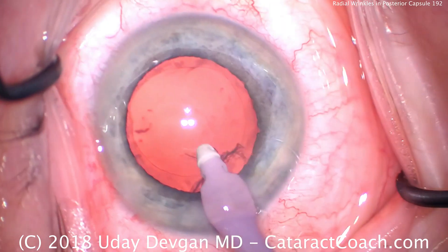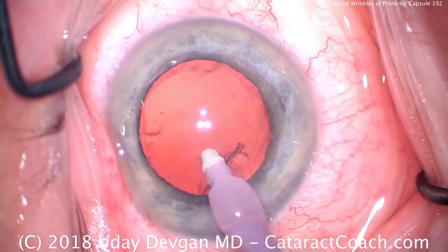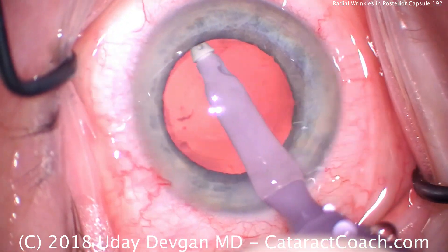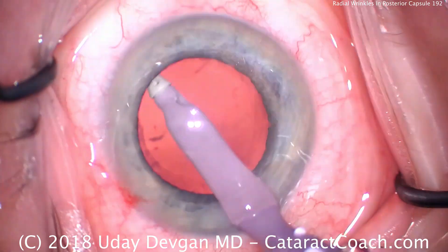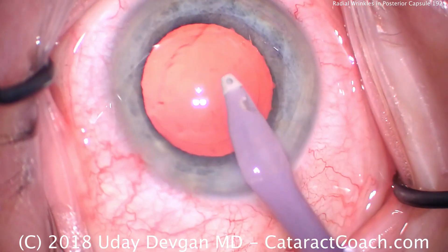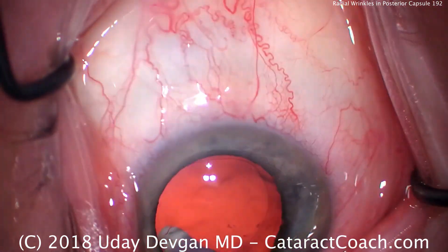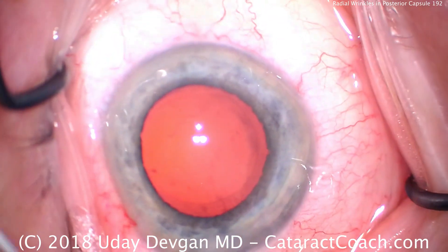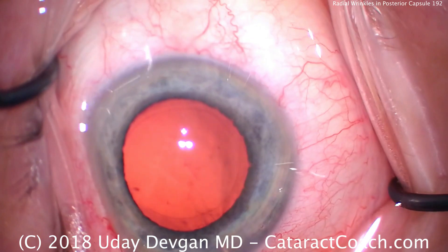Pivot more. We want to get just the cortex and not the capsule. There it is. Bimanual irrigation aspiration can help here as well to access that. Some people even use a 27-gauge cannula through the side port, or a J-shaped cannula through the main incision to get the sub-incisional cortex. But we did it just with the regular IA probe.